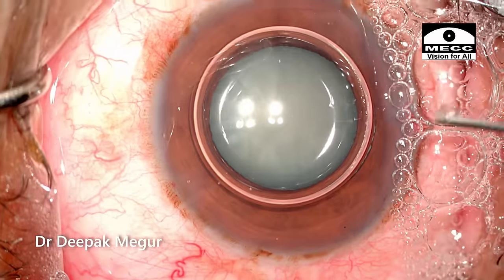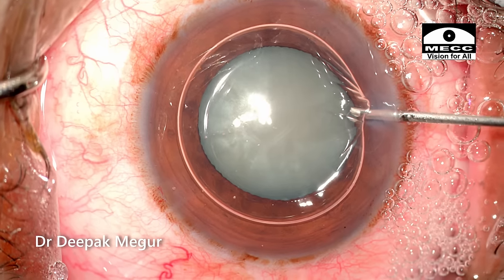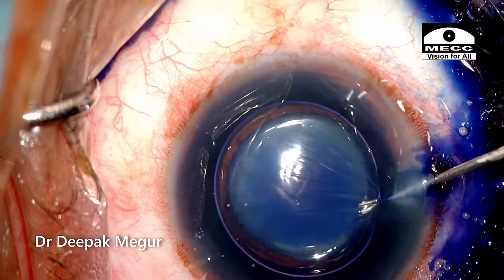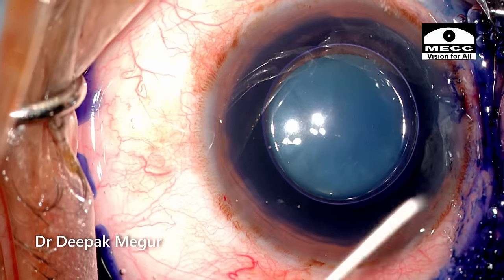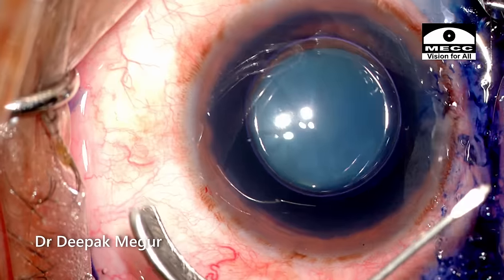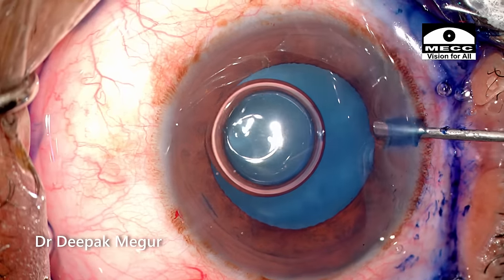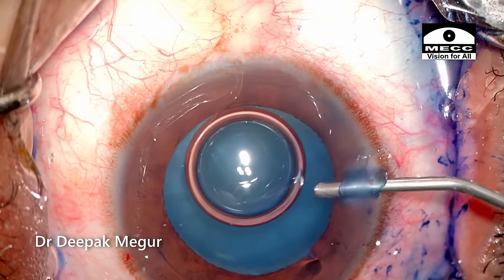Air is injected in followed by preservative-free xylocaine, about 0.2 to 0.3 ml. During this time, I bend my cystotome and this gives me about 20 seconds for the dye to stay in the capsule well enough. Dispersive OVD is injected into the anterior chamber creating enough pressure for me to perform a good incision.